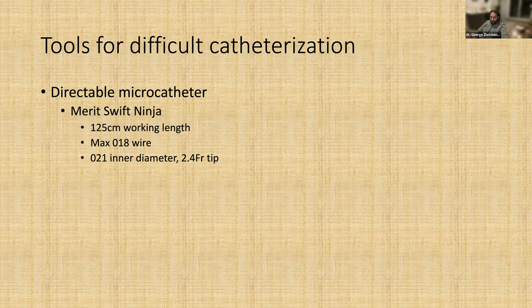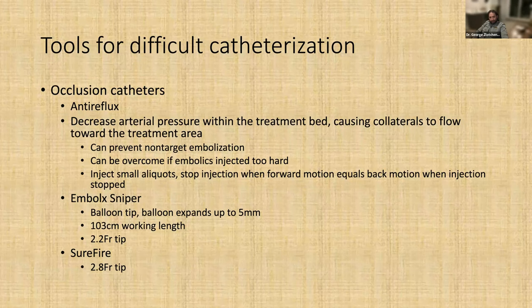There are also occlusion catheters that are anti-reflux, if you have some non-target vessels that are very close to the origin of your prostate artery. You can play around with those.